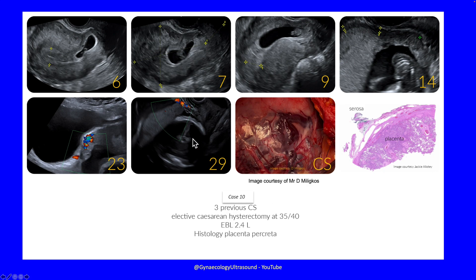Choosing one case: at six weeks, seven weeks, and nine weeks gestation you can see the pregnancy beginning to fill the cavity. At 14 weeks there is very little residual myometrial thickness. The placentation is going toward the bladder but not actually invading it. At 29 weeks, similarly at hysterectomy, you can see huge vessels and a very deficient section scar. She had a caesarean hysterectomy, and placenta accreta spectrum — percreta — was diagnosed at histology.